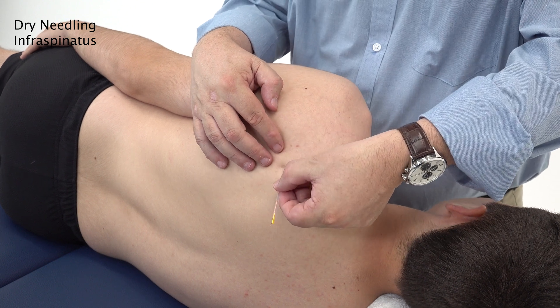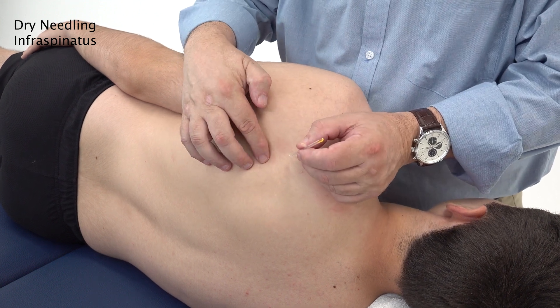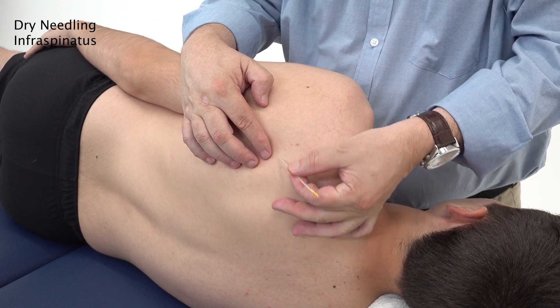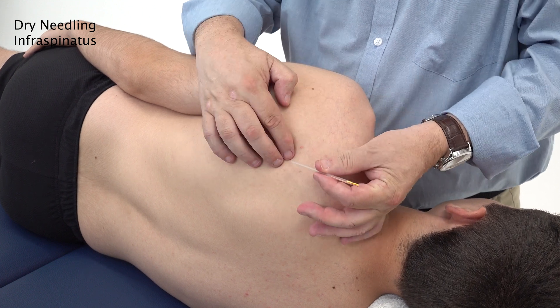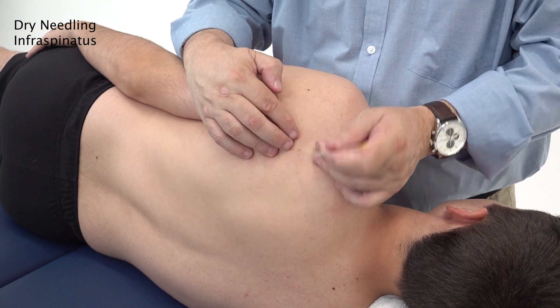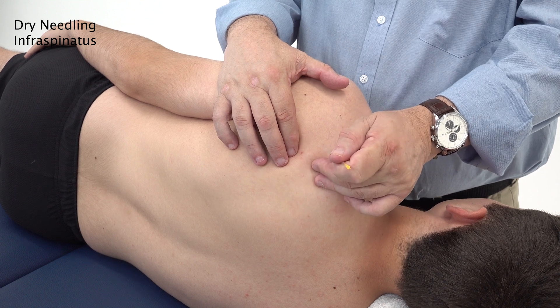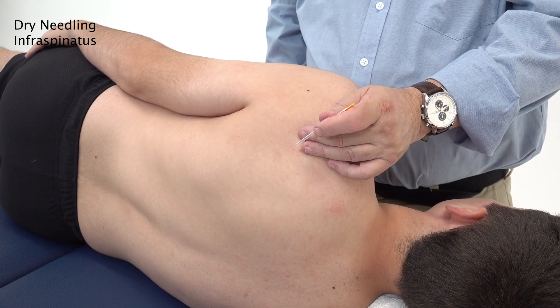Needle from a medial to lateral direction, though it's also possible to needle the inferior portion in an inferior medial or superior lateral direction - coming inferior medial to superior lateral in the bottom part of the infraspinatus. Remember you may be around teres minor and teres major in those areas as well. Just be careful to stay below the spine of the scapula and don't go in a posterior to anterior direction, as you may go through the muscle and through the scapula itself.